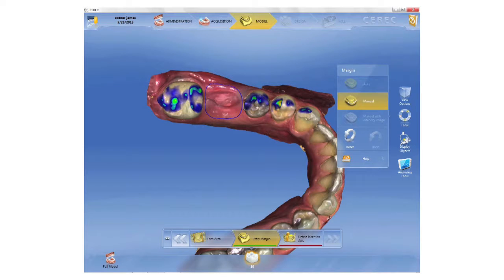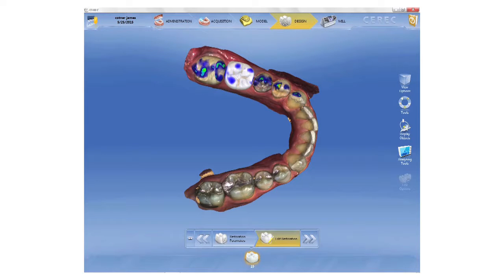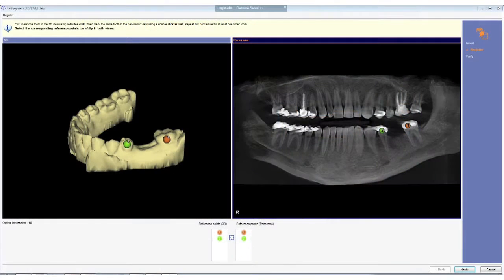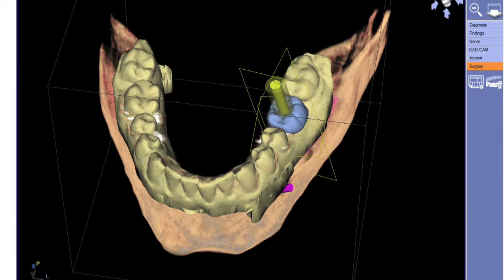This is what we do. I do it digitally, so I get to plan my implant ahead of time. I plan the prosthesis, how it's going to look, and then I actually take the 3D scan, the CBCT, and take the digital impression, and I'm able to correlate those together.